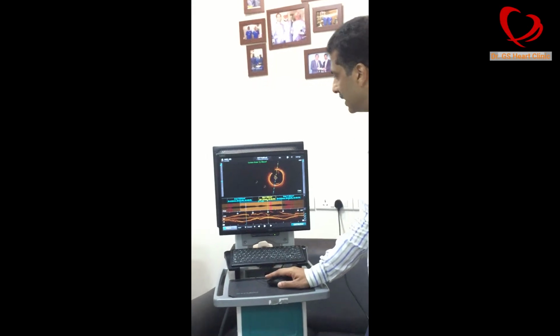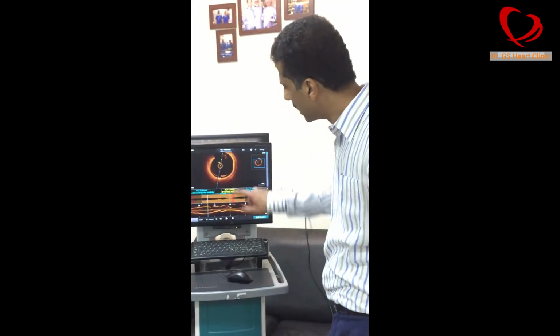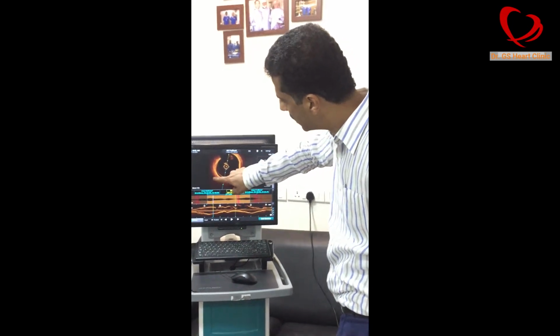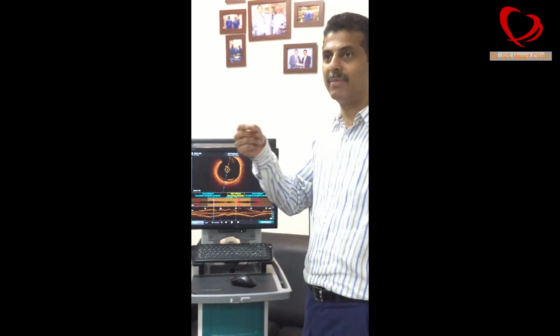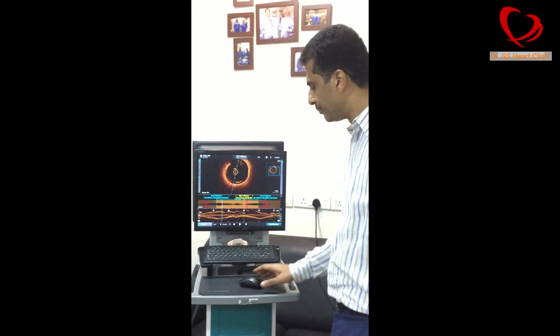Okay. And the nature of the plaque, for example, the normal vessel looks like this. If I enlarge it, the normal vessel has 3 layers. You can see the 3 layers: intima, media, adventitia. This is the normal 3 layers. But here you don't see 3 layers. This is all diseased artery. The artery is getting some sort of early blocks coming up. In his case, the entire artery is slightly diseased. So it has a tendency to develop blocks.